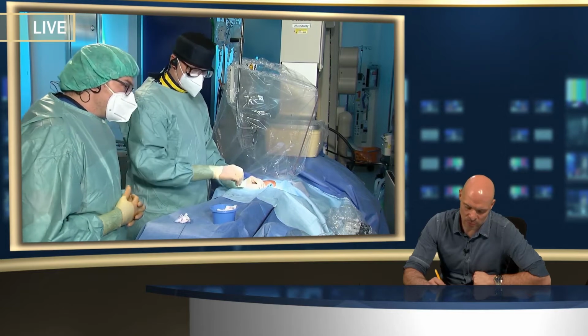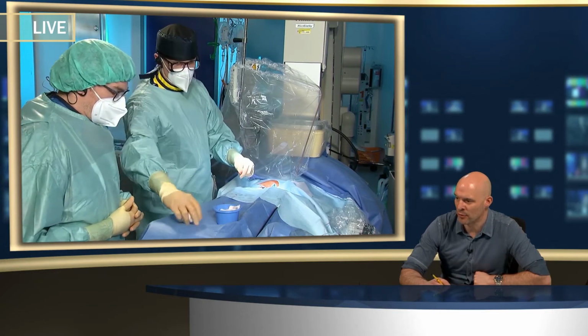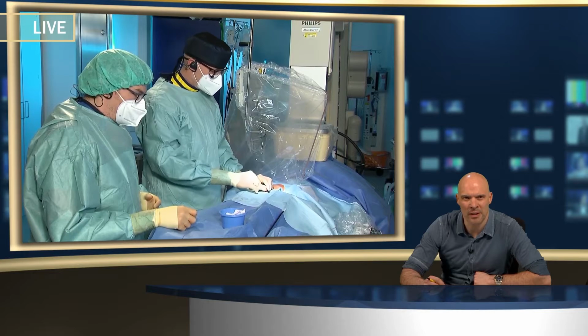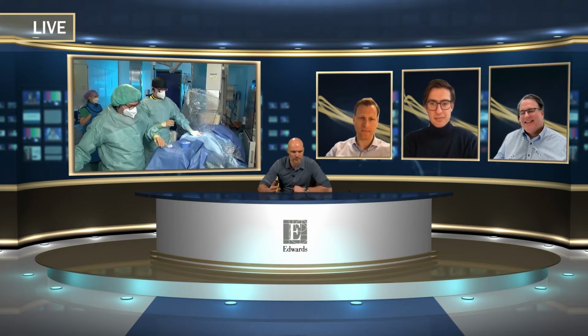Why don't you proceed with the case, and we will discuss some of the features that we heard from the presentation. So the first thing that I would like to ask Stefan is this now functional or secondary TR, or would you call this primary, or is it mixed, in your opinion? So this would be a secondary MR.